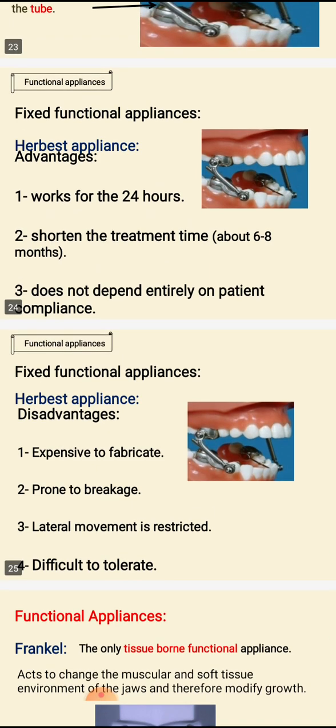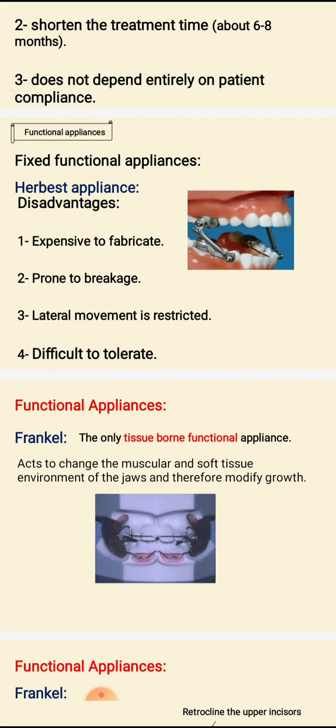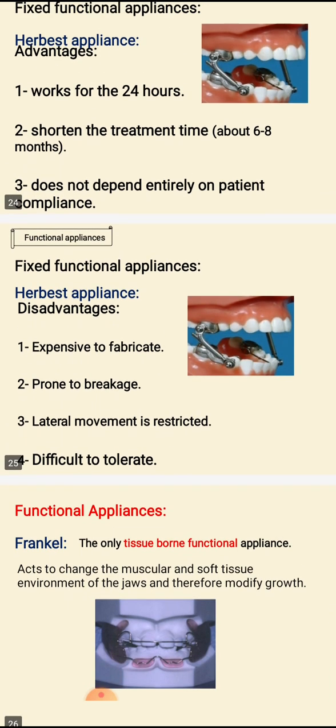So it's not all good; Herbst has its advantages and disadvantages. Herbst appliance is a fixed tooth-borne functional appliance.